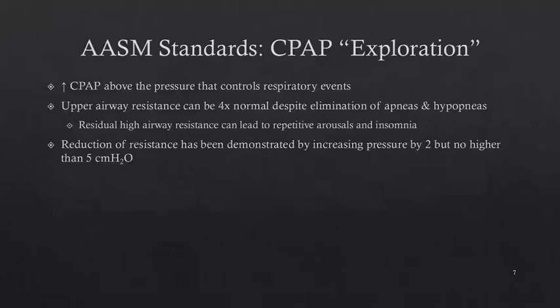The ASM does allow for us to do CPAP exploration, which means that once we find what we think is the optimal pressure for the patient, we can then go a little bit beyond that to just somewhat show a range, so to speak, or explore.